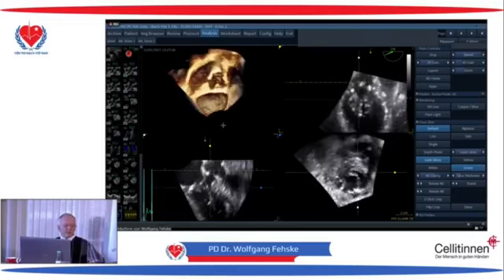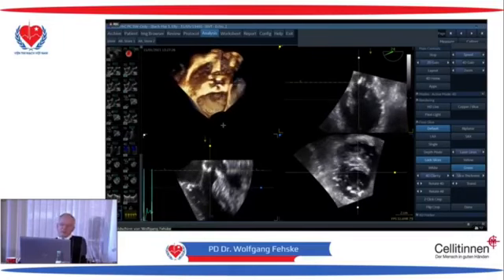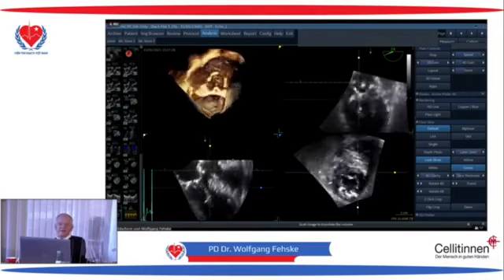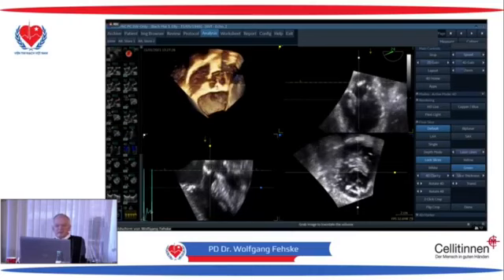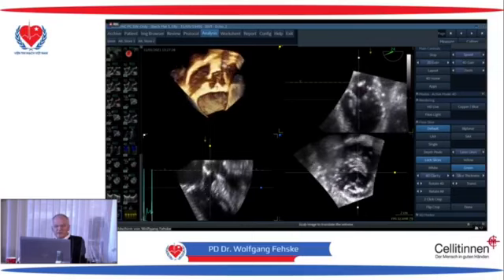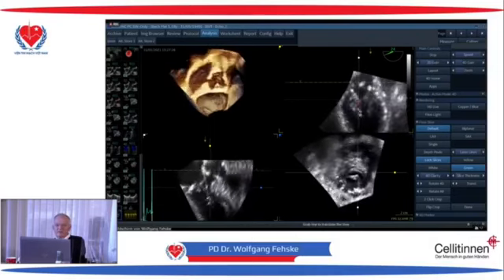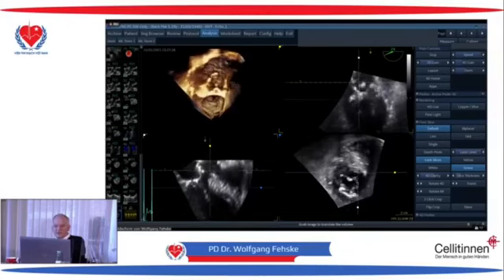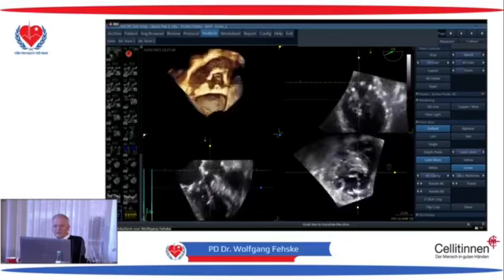We have not so much time left. I want to show you at least one mitral regurgitation, but you see the problem here is that I'm cutting the left ventricular outflow tract. This is the aortic valve. This is the anterior leaflet, which shows already some restricted motion if you look at it directly like that, and then look for the mitral valve opening.